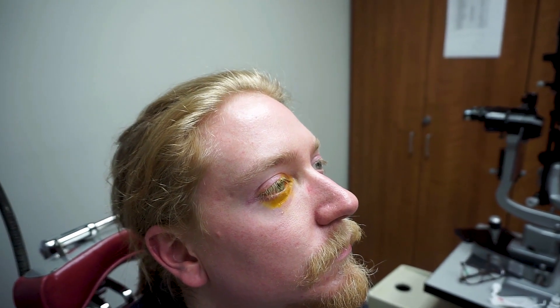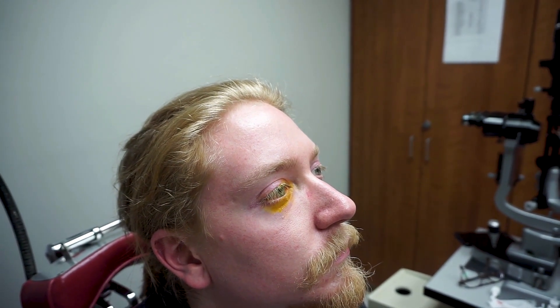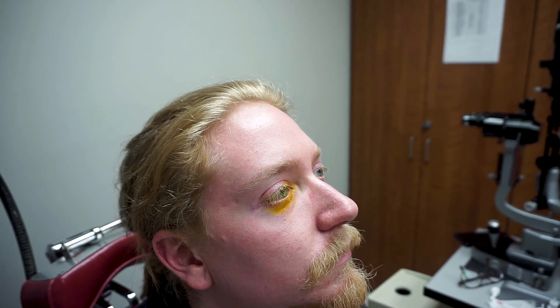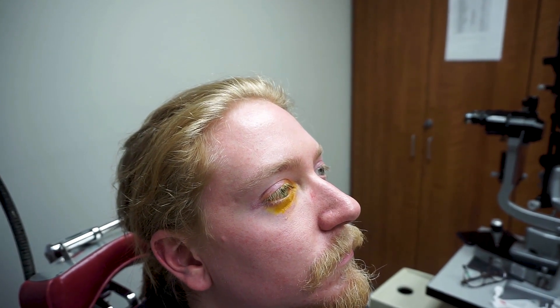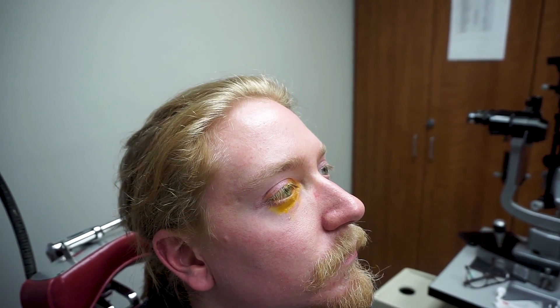Once the stain has been applied, evaluate the eye with a cobalt blue light, either with a Woods lamp or slit lamp, to identify any corneal abrasions.